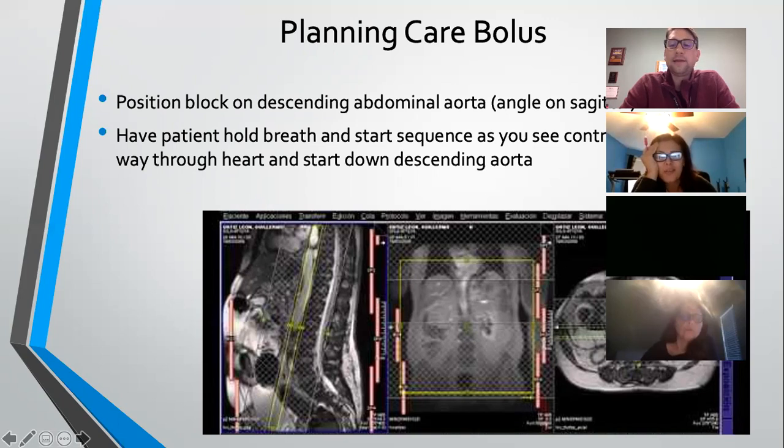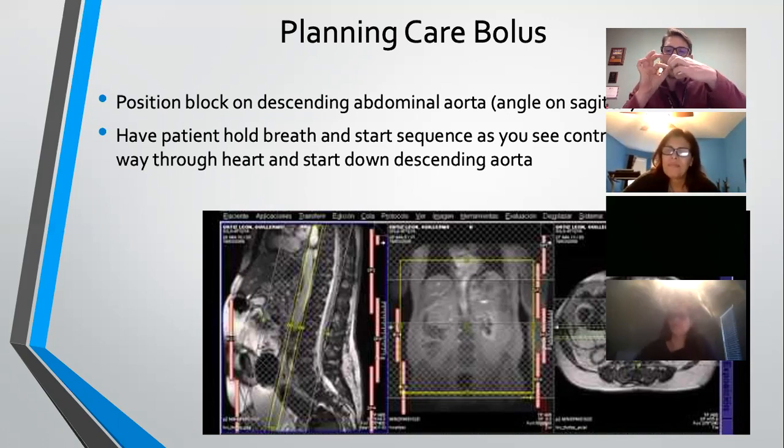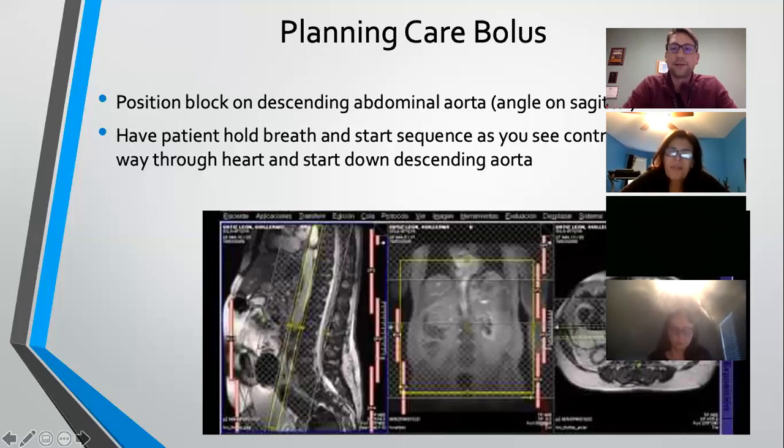Yeah, and I mean, you need dynamic imaging of the pituitary, because remember, the pituitary is one of those glands where the gland actually lights up with contrast, and then the tumors, the microadenomas, are so small, but they usually take a little bit longer to light up with contrast. So the pituitary gland lights up with contrast, the microadenoma does not, and then it slowly does. So you need to see it in real time. You need to see it in arterial, you need to see it in venous and delayed phase.